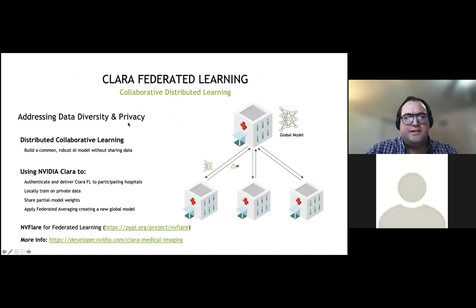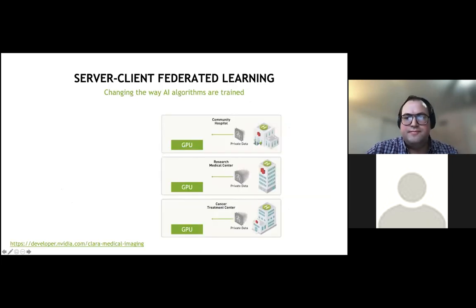In NVIDIA Clara, which is our SDK to perform training for deep learning and medical imaging, we developed a federated learning solution based on the server-centric model, where we have a central server that initializes the training and provides an initial global model. That global model is then distributed to different hospitals. They train on their local data and send back weight updates to update the global model. The updated model is sent back, and this process is iterated until convergence.